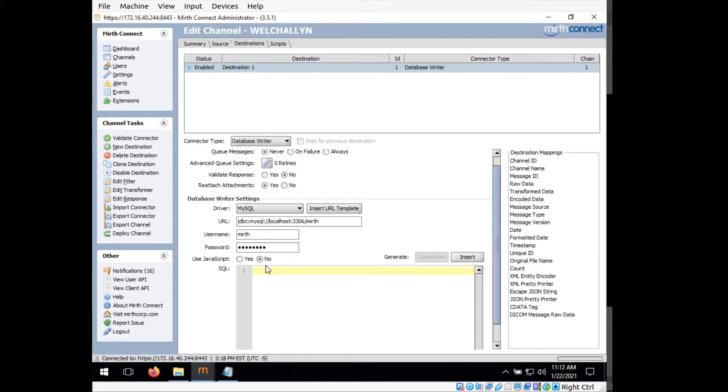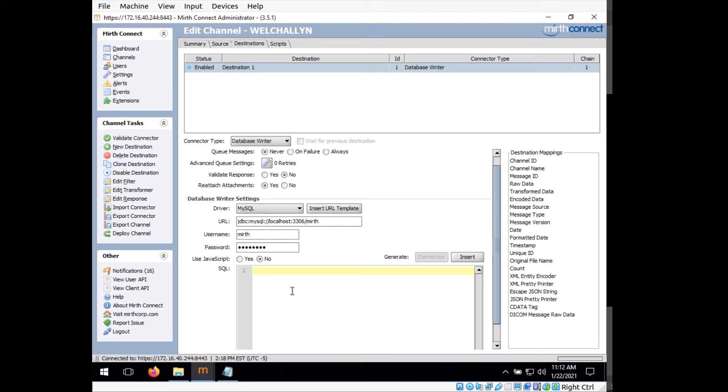And now we have set up the connection between Mirth Connect and the database. So now underneath this, you see the SQL text box here. This is where we'll enter in the SQL query that Mirth is going to use to insert records into the database. But before we can fill this out, we need to clean up the input a little bit.